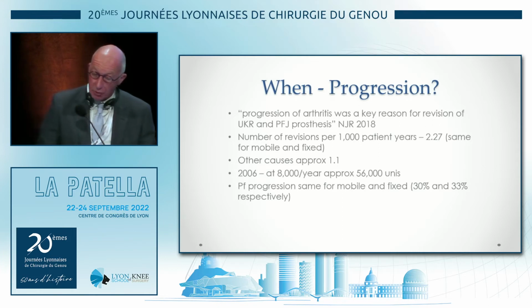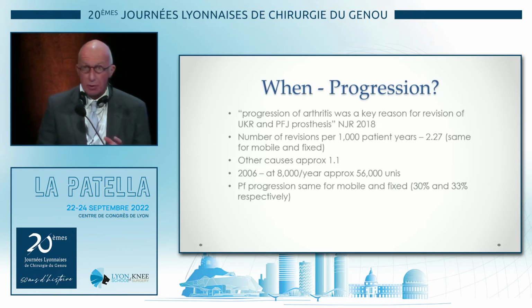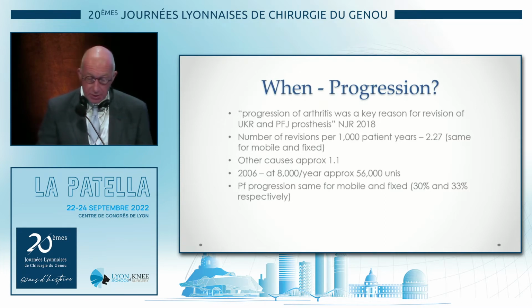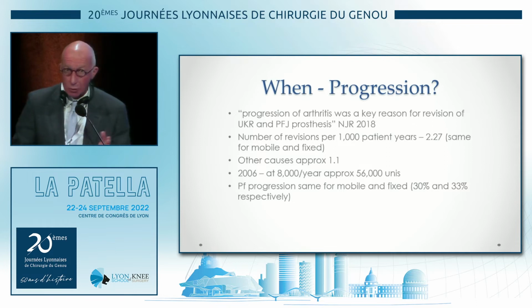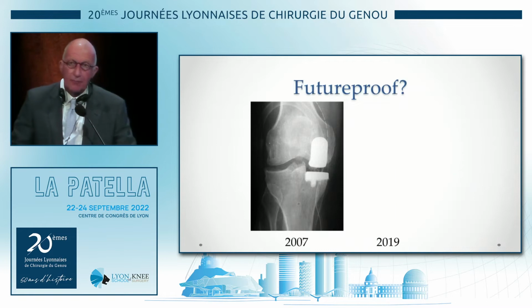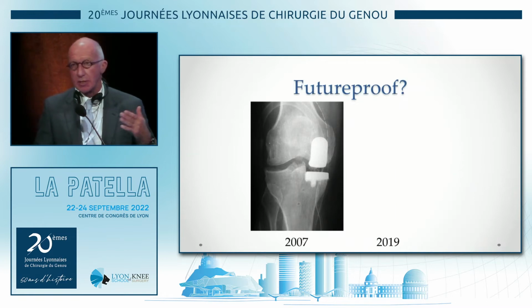So we hear about progression in a lot of these talks, the progression from a uni to patellofemoral, or progression of patellofemoral to medial disease. And that's the same whether it's a mobile or fixed design. It's about 30% in both. But for me, this is not a stepping stone into a total knee. Why should you do a total knee?